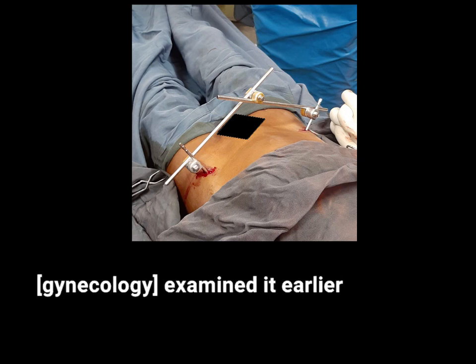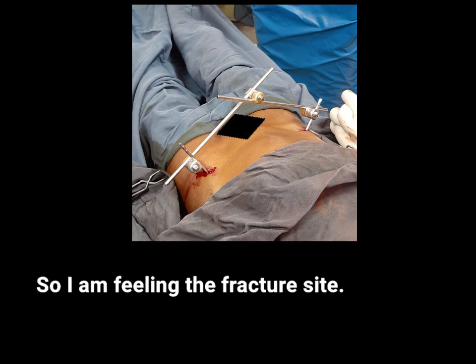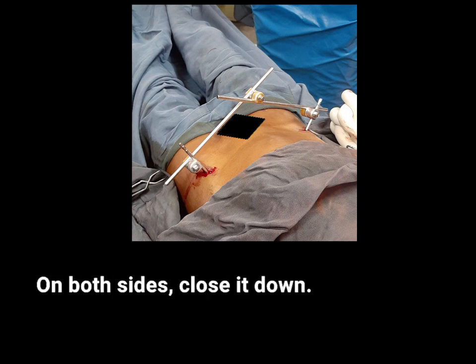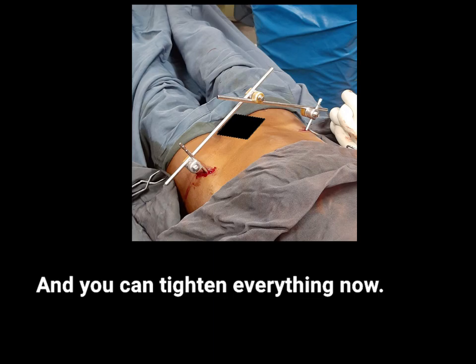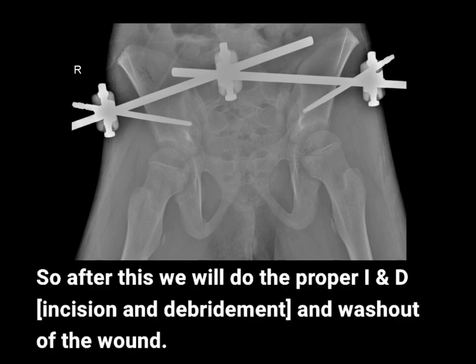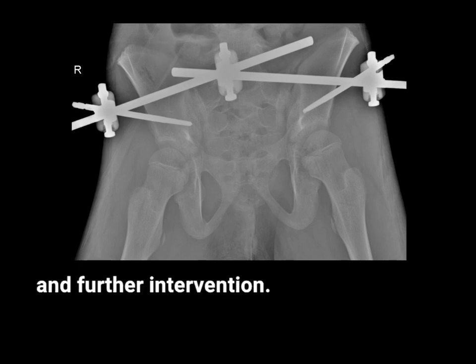In this specific patient, the traumatic wound was examined by gynecology earlier and they were able to reach the fracture site. So I'm feeling the fracture site here. Since this is actually open, the gap right here has to be closed down — close it down on both sides. My finger is feeling the reduction here. A little more — there you go, now it is closed and you can tighten everything. After this, we'll do proper irrigation and debridement and washout of the wound, and the urology side will continue with their examination and further intervention.